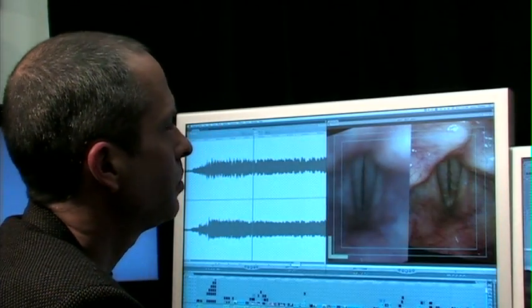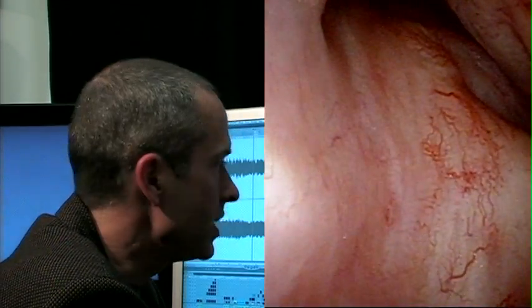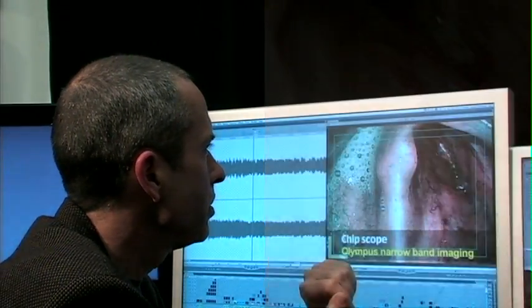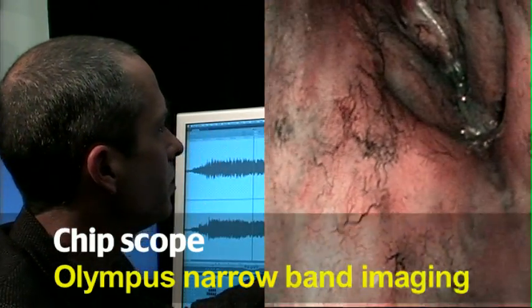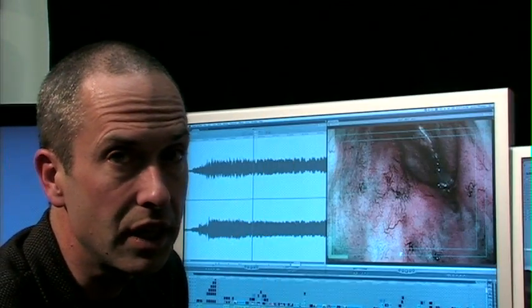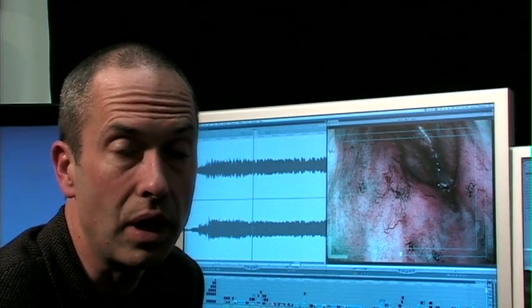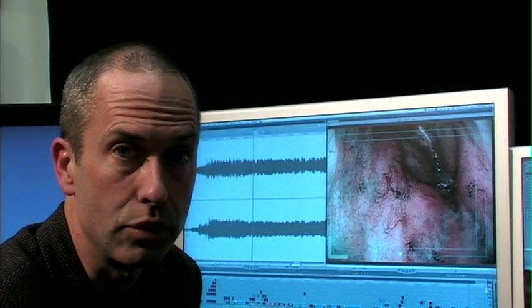Here's a patient who had radiation therapy, so their blood vessels are a little prominent anyway. If we turn on what's called narrowband imaging, now we really see those blood vessels quite well. Blood vessels are related to certain kinds of tumors, so this might be a useful feature if you're looking for tumors on the larynx.